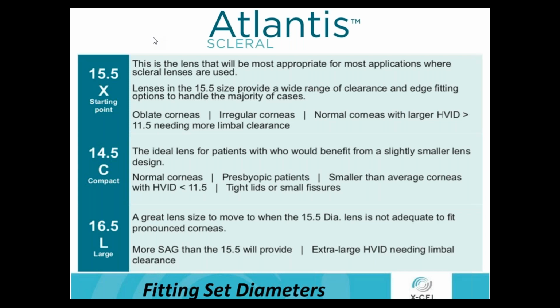Well, now going back to the instrumentation that we have out there that can measure beyond the sclera, we know that even at a 15.0 millimeter chord, there is toricity, and we know that as we go larger, it creates more toricity between our two meridians, and we'll talk about that in our edge design. So in our generation 1 set, 15.0 was our standard lens and our go-to starting point.